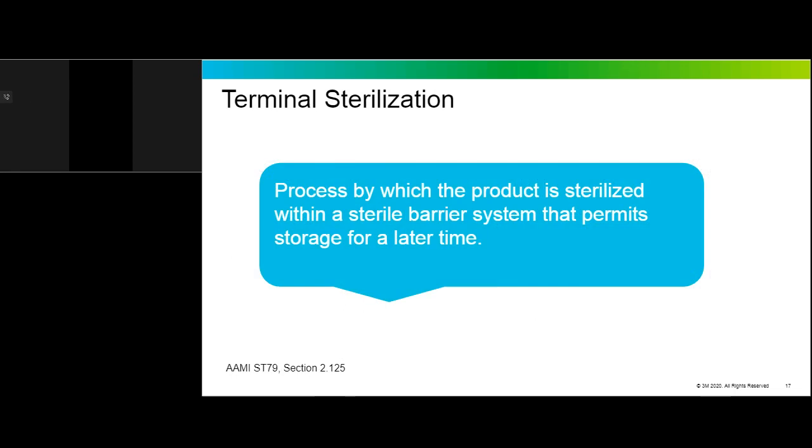Another term you may sometimes hear is terminal sterilization. And you might wonder, what the heck is that? That simply conveys that the load items are packaged prior to sterilization, so they can be put on the shelf and stored until you need to use them. When you think about the packaging attributes, they may allow air removal and steam penetration during the sterilization cycle, and then during storage, they need to provide a microbial barrier so that the sterility of that sterilized item is maintained until use.